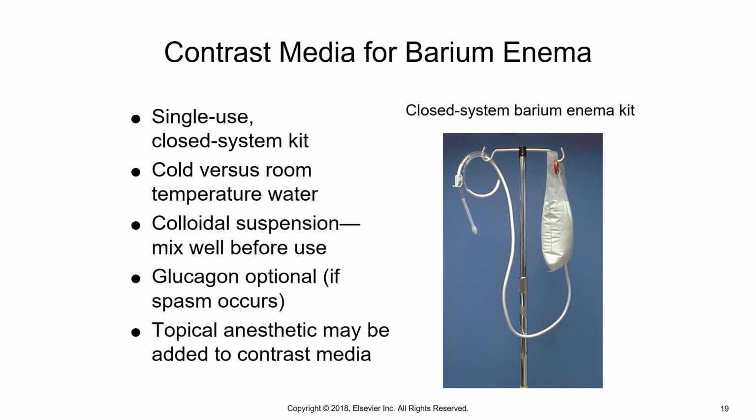The contrast media that is used for a barium enema, typically we are using barium sulfate as our contrast media, but if the patient did have any of the three contraindications, which are possible obstruction, possible perforation, pre or post surgery 48 hours, or if they've had a sigmoidoscopy or a colonoscopy with biopsies, then we would use the water-soluble iodinated contrast media.